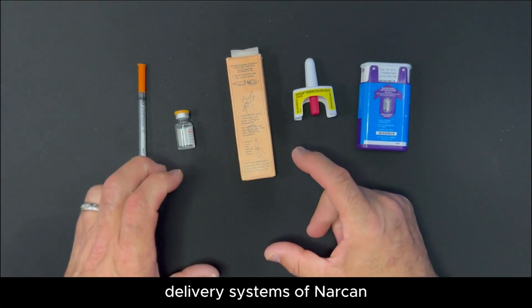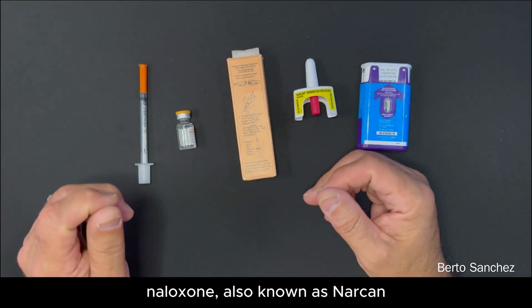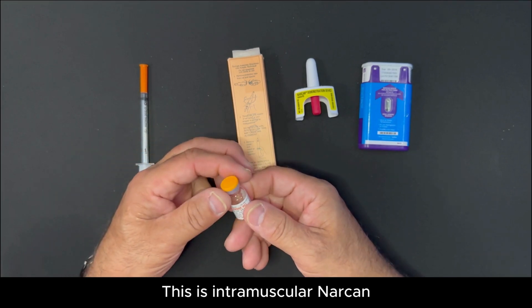We're going to go through the different delivery systems of Narcan, also known as Naloxone. This is initially what we started with in Massachusetts. This is intramuscular Narcan.